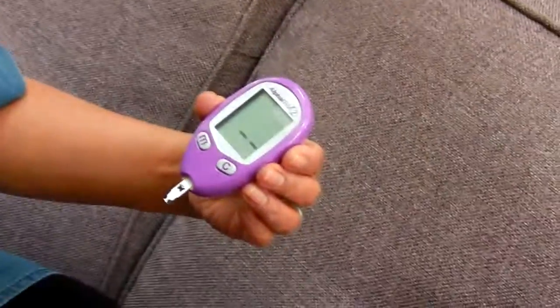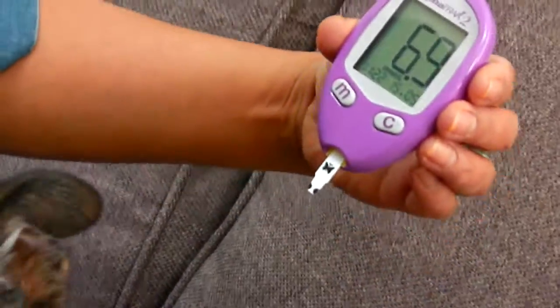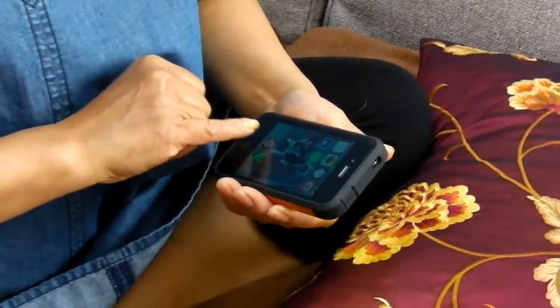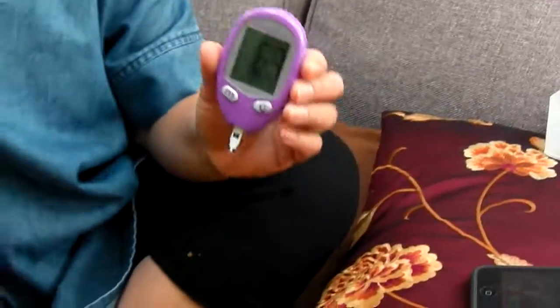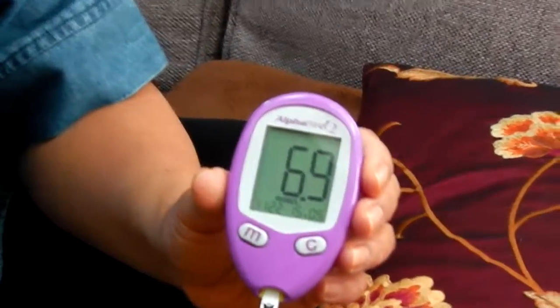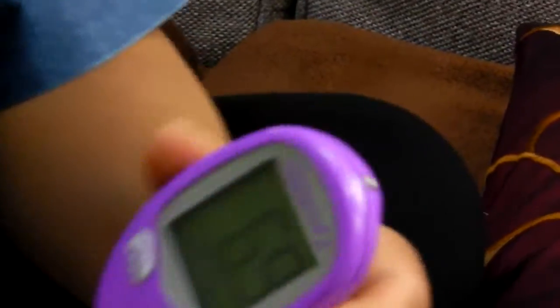Good girl. Let's see the result. The reading is 6.9.